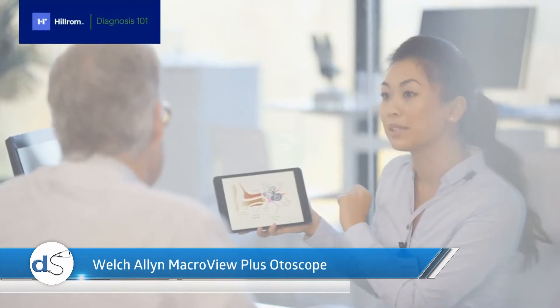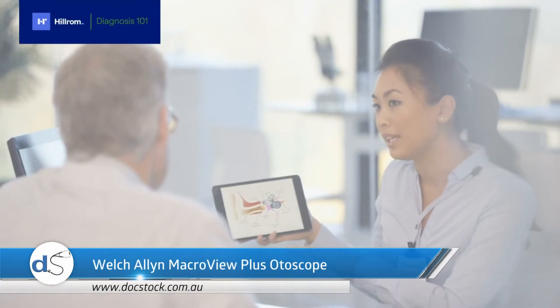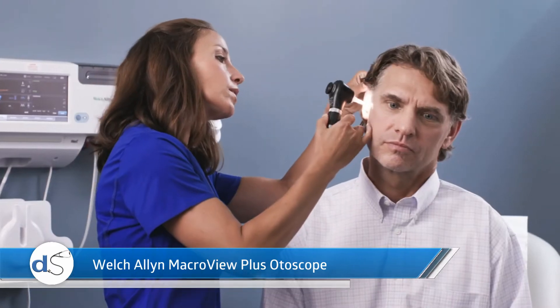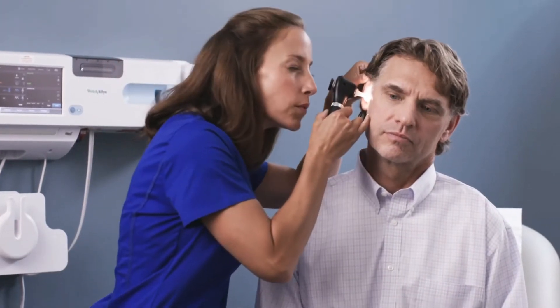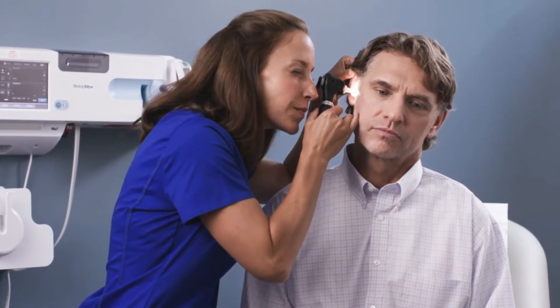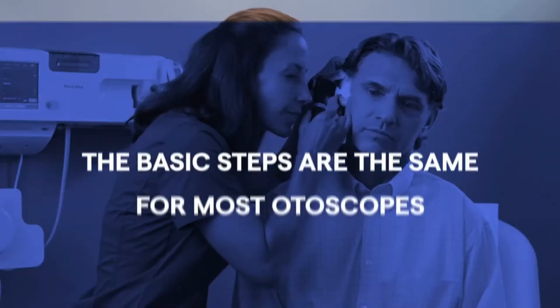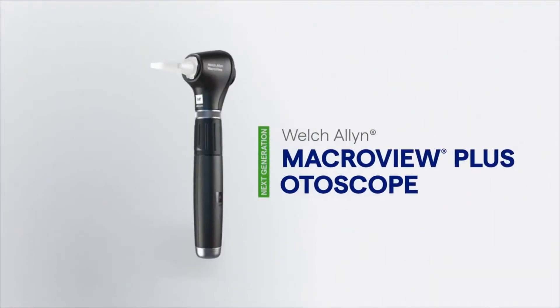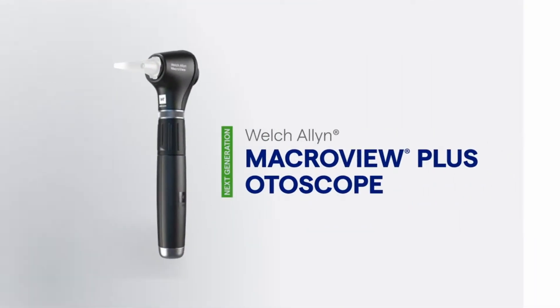Examining the ear is the primary method used to diagnose patient complaints for the entire ear, nose, and throat complex. The otoscope helps you magnify the details and definition of the ear canal and the tympanic membrane. The basic steps are the same for most otoscopes, but we'll be showing you how to use our wide view Welsh Allen macro view plus otoscope.